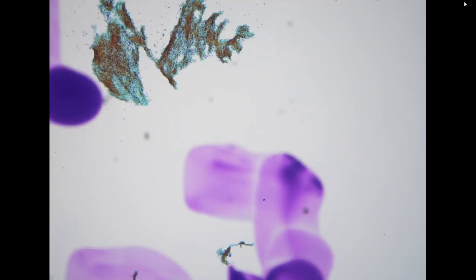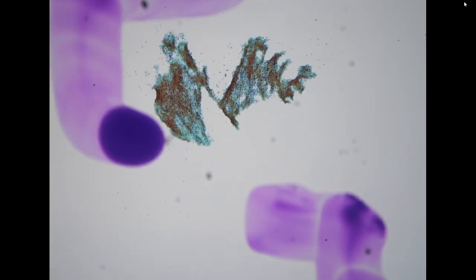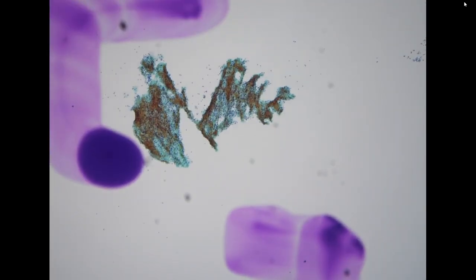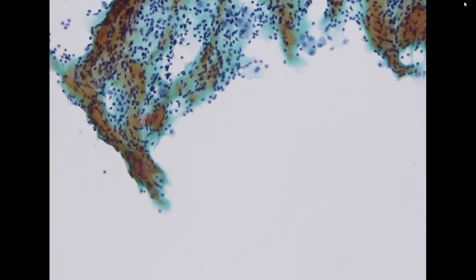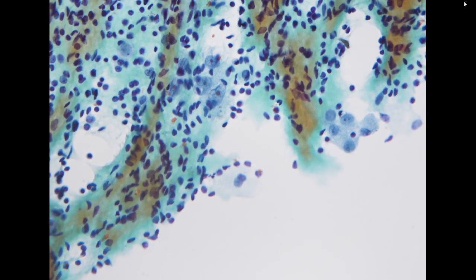The next specimen is a pleural effusion specimen. The patient had a past history of primary lung adenocarcinoma. In this specimen, there is some proteinaceous material inside the body fluid, the effusion. For the cytospin smear, we see a lot of cohesive cells with some sort of material in the background. So we need to go to high power to check if there's any diagnostic cell.